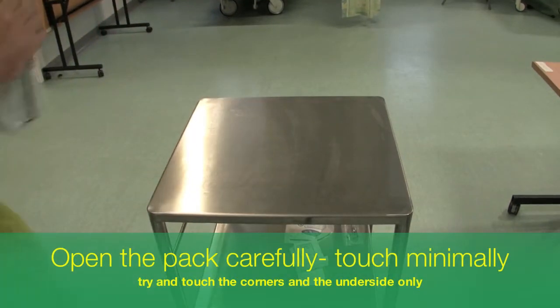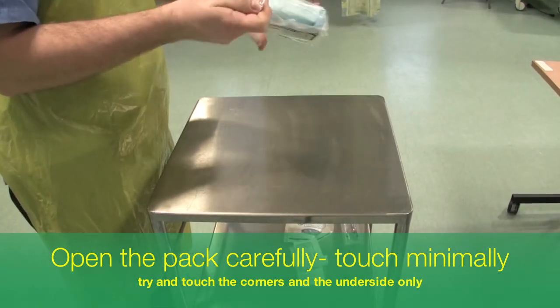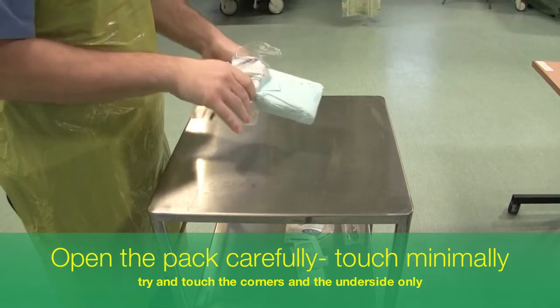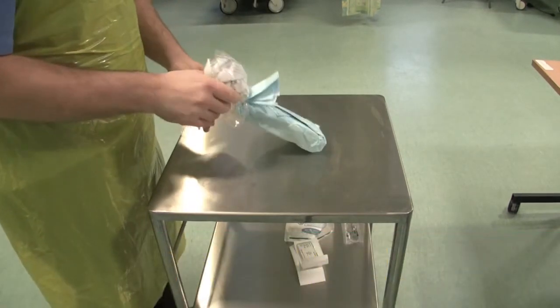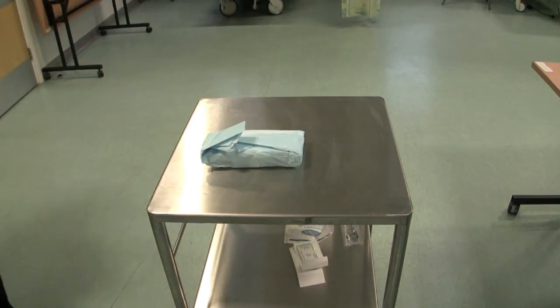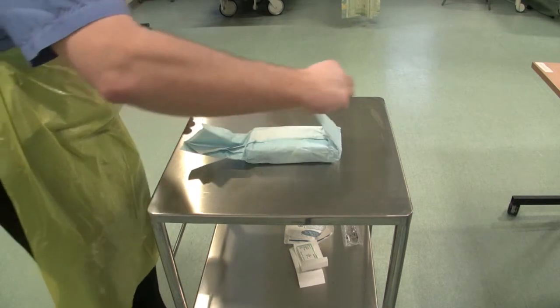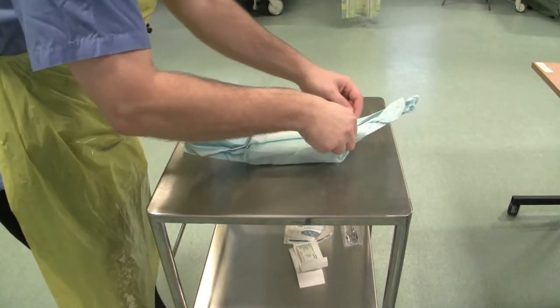When opening up the pack, be very careful when opening the outer packaging that you don't touch the sterile field which is inside. When opening up the field, try to only touch the underside of the field and the corners so that any of the sterile contents are not in contact with areas you have touched.